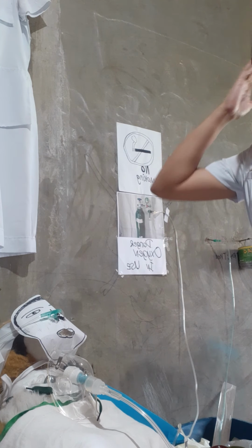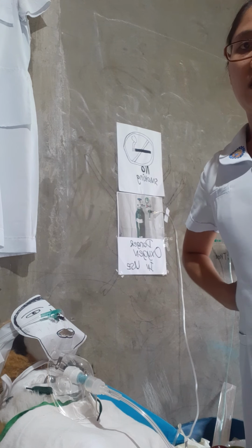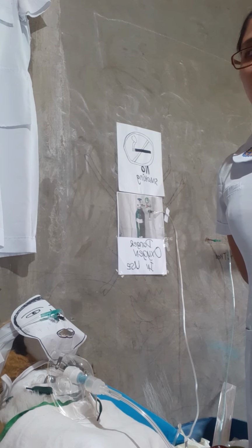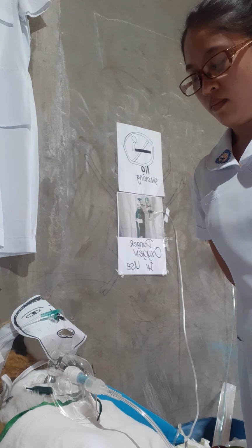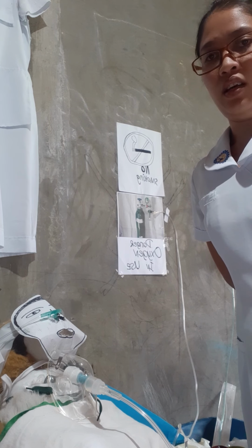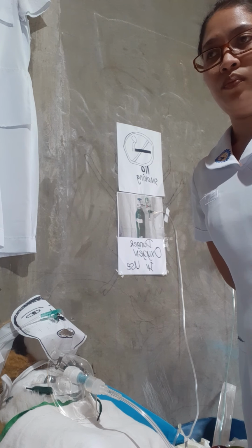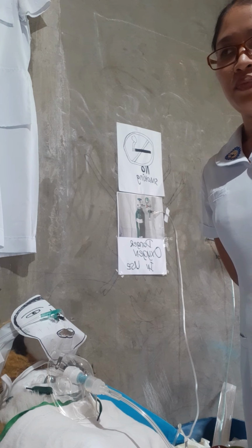Then when suctioning, we see not too much secretion, but a small amount, and it was white in color.